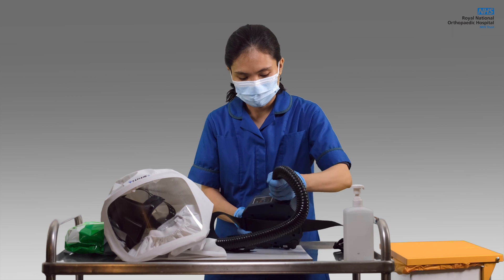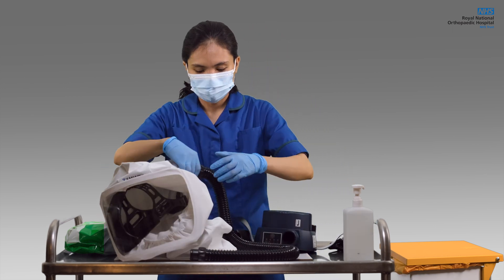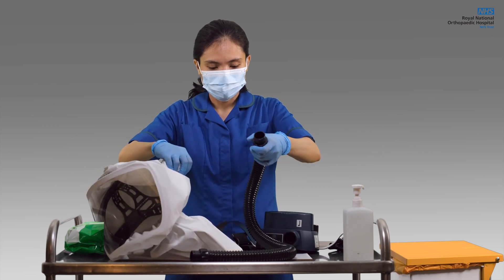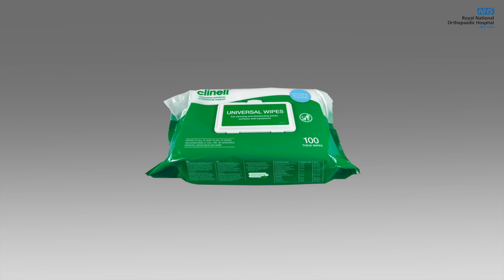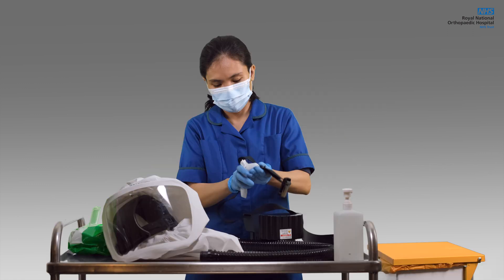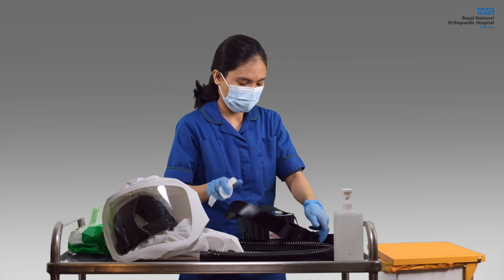Disconnect the hood, hose, belt and unit for proper decontamination. Make sure you have ample Clenelle Universal wipes within arm's reach when decontaminating. First, wipe the belt, the hose and the unit, then set it aside.